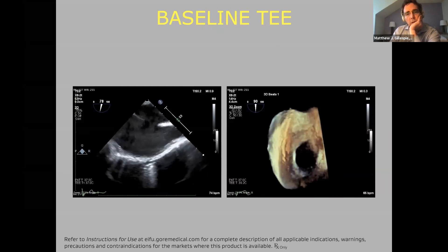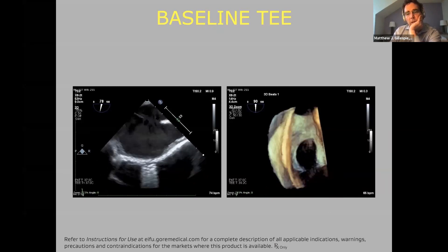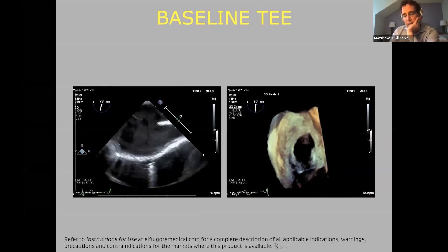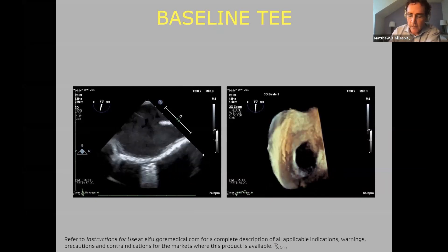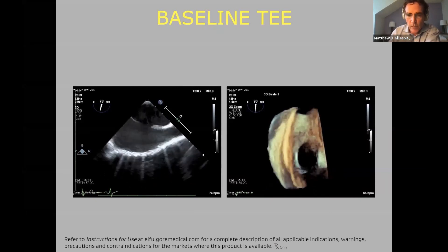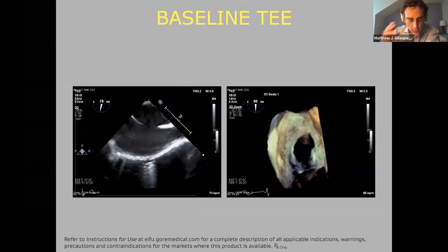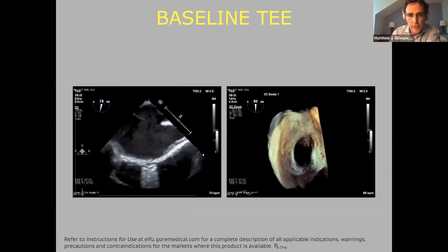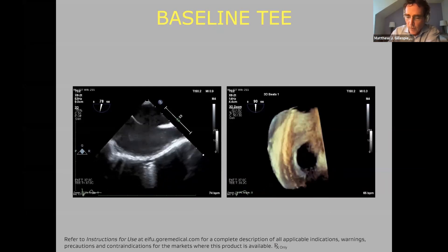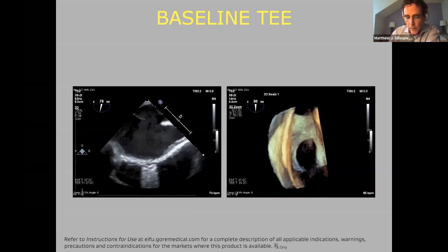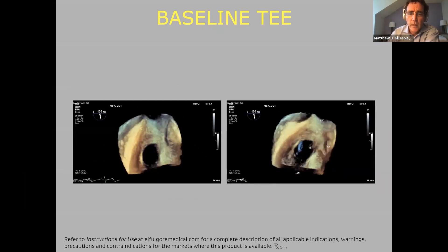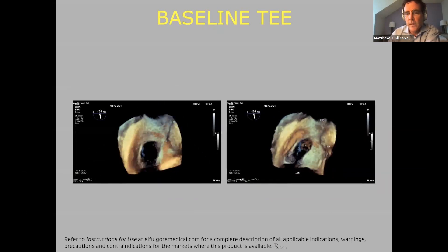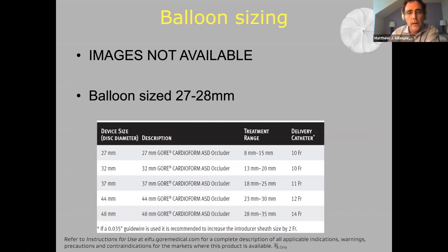TEE can give you these great real-time 3D images, which are not necessarily required but are helpful pre and post to form a picture in your mind of what the ASD looks like — where it is relative to all the rims. That's what the ASD looks like from the RA and LA sides by 3D Echo.